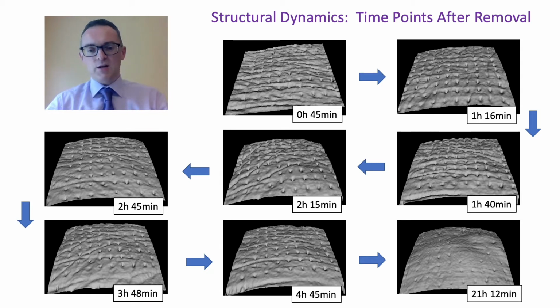And as I mentioned at the beginning, the true skin barrier has probably resolved within 15, maybe 30 minutes, depending on the microneedle design, but we can still see these indentations on the surface of the skin and measure those using optical coherence tomography.